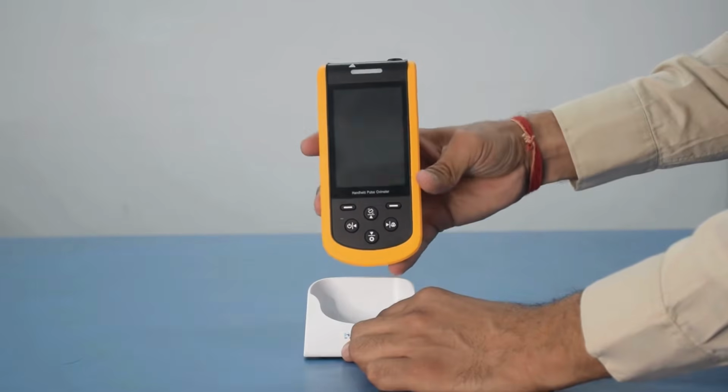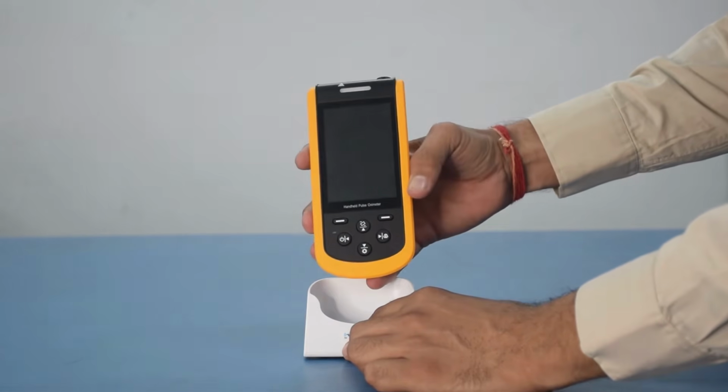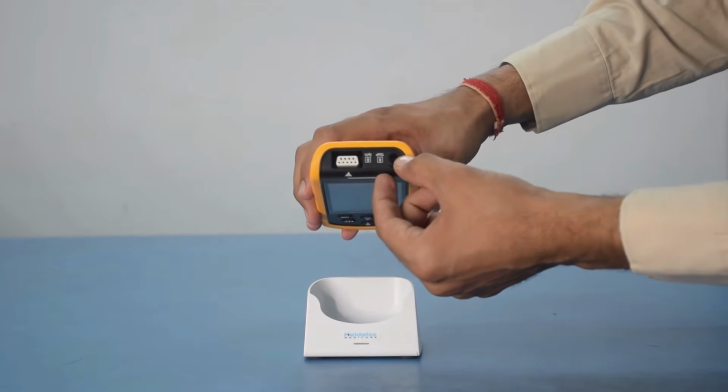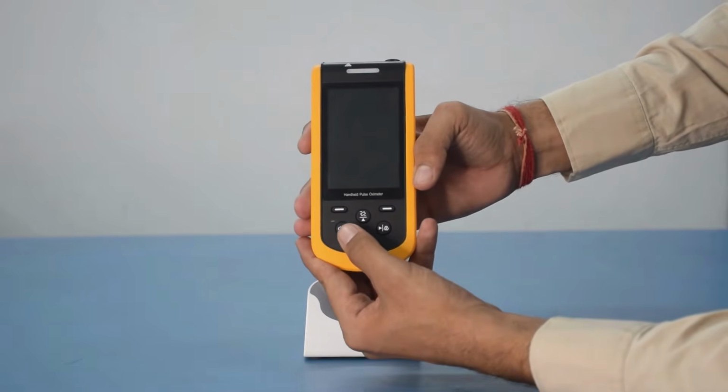So this is our equipment, pulse oximeter. You can see that it is very handy to use, just like a smartphone. From the upper side, you can see there are two ports. The first one is for SpO2 and the second one is for temperature. And now I am going to tell you how to use it.